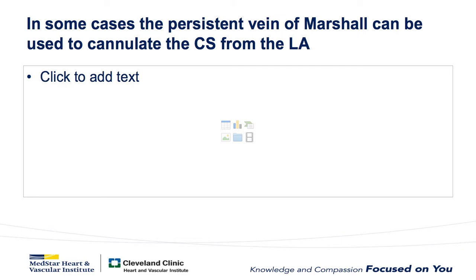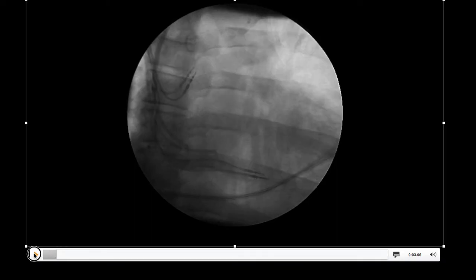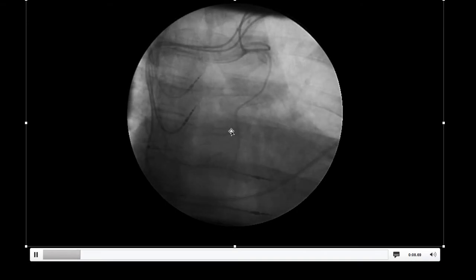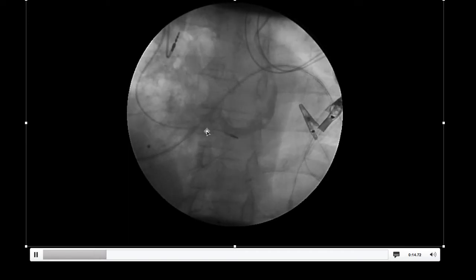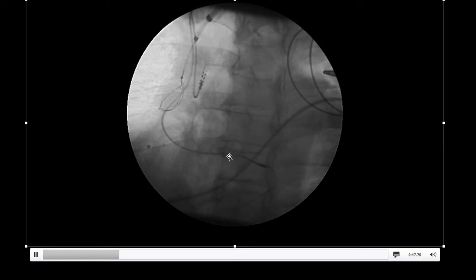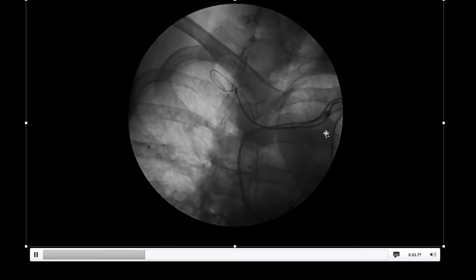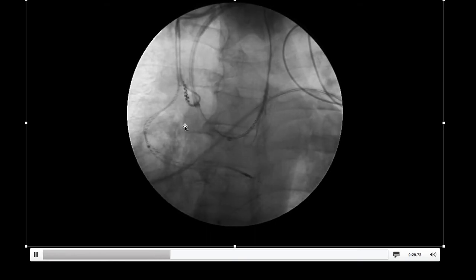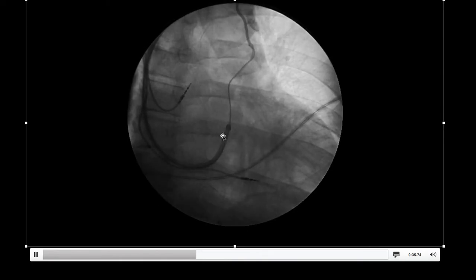In some cases, you can actually use the vein of Marshall to cannulate the CS. If a fair amount of blood return is present, as in this case — couldn't find the CS on previous attempts, very small vein of Marshall — you'll notice there's a relatively large opening of the coronary sinus into the right atrium; it was just very difficult to locate. So we sent a wire down the vein of Marshall into the right atrium, got a second access, and were able to snare the wire and then use that wire to pull ourselves into the coronary sinus.